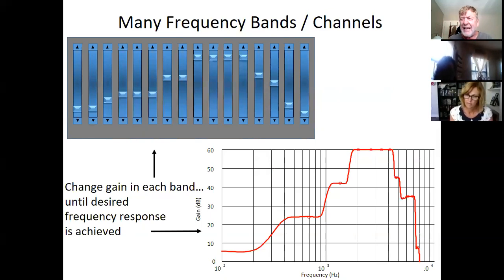And now today, you can throw Bill and Till over, they can go play in the playground. We don't need them anymore. Today, Bill and Till have disappeared because hearing aids have more than 2 channels. They've got like 25. So Bill and Till are like yesterday's concern. We just provide WDRC in this channel, WDRC in this channel, and so on.